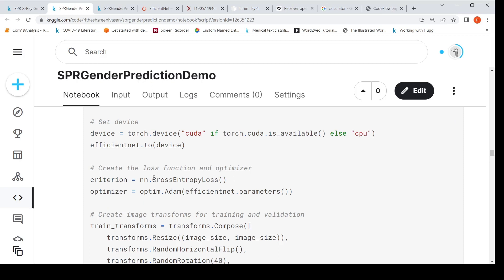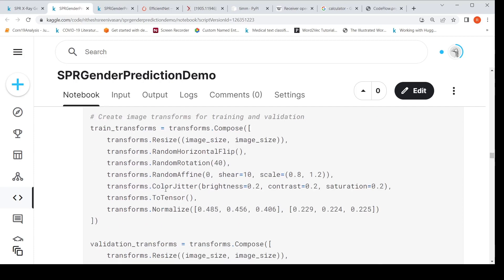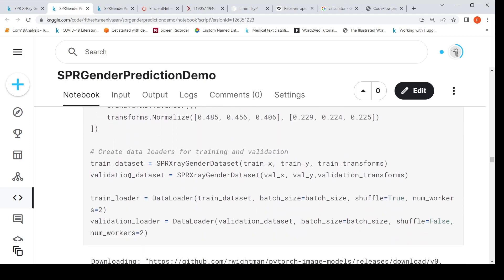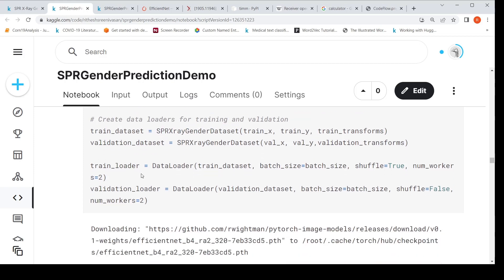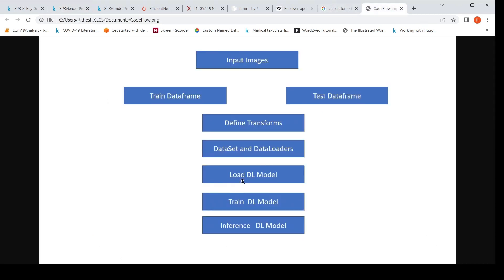I define a loss function and optimizer for training. The loss function is cross-entropy loss because we are doing binary classification. The optimizer is Adam. I then create the train dataset and validation dataset by calling the dataset class with the list of files and transforms. I also create data loaders for training and validation data. So now in the code flow, we have completed up to this stage and we need to train our deep learning model.